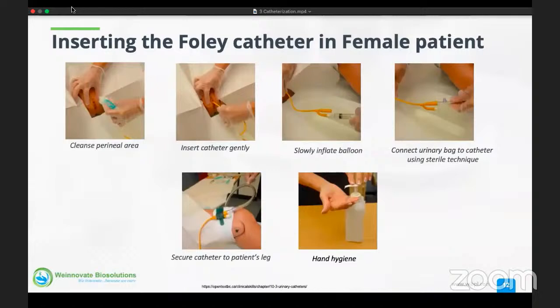Insert the lubricated catheter into the female patient's urinary meatus very carefully. Angle the catheter upward as it is advanced. If the catheter will not advance, instruct the patient to inhale and exhale slowly, and then it will be inserted. The breathing will relax the sphincter muscles. Do not force the catheter. When urine starts to flow out, insert the catheter approximately 1 inch further. Then place a cup under the stream, and if you want to collect the urine, you can collect it at this point of time.